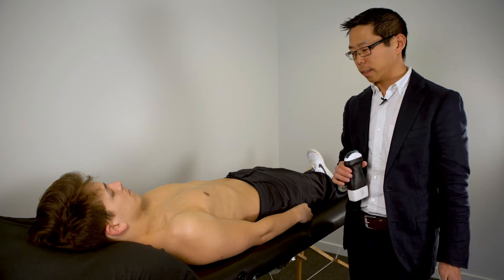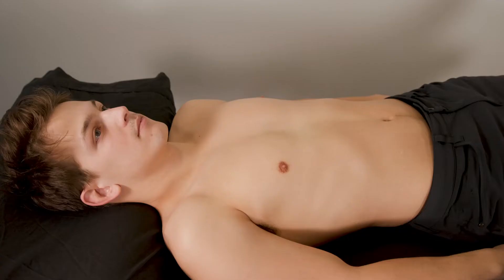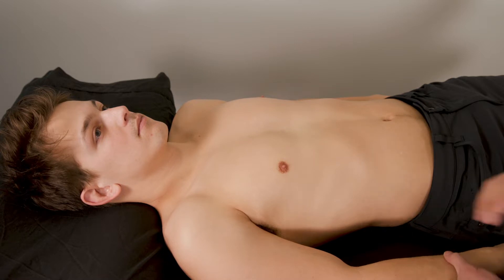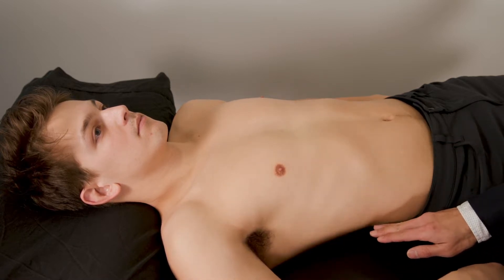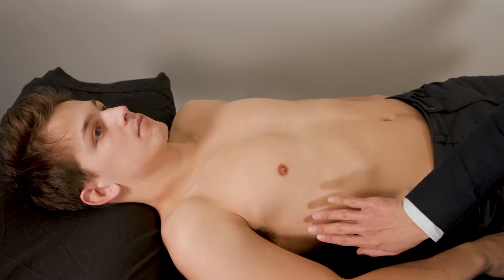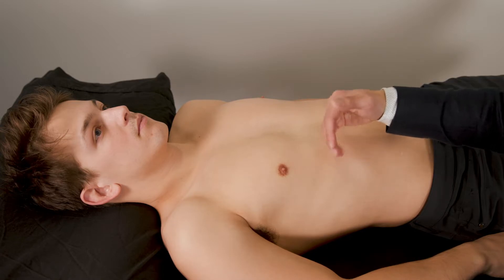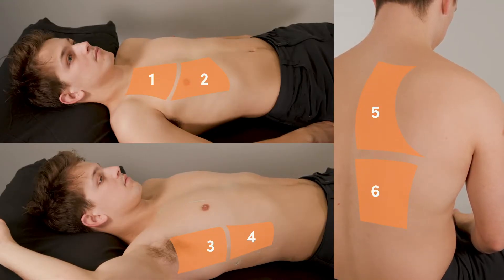For lung ultrasound scanning, the idea is to interrogate as much of the chest as possible. Therefore, divide each hemithorax into six zones. The landmarks we're going to use are our anterior axillary line and our posterior axillary line, which delineate our anterior chest, our axillary chest, and our posterior chest. Each area is divided into an upper and a lower zone, providing us with six different scanning areas.